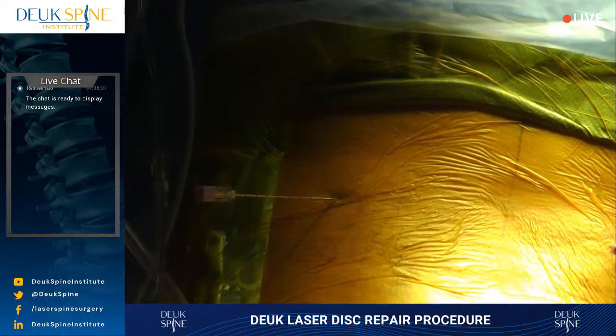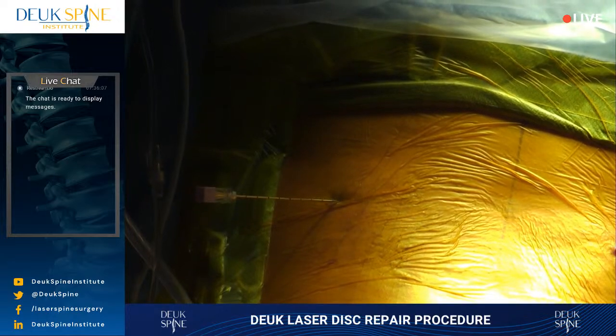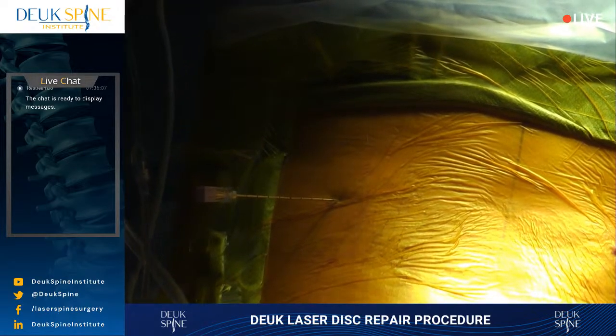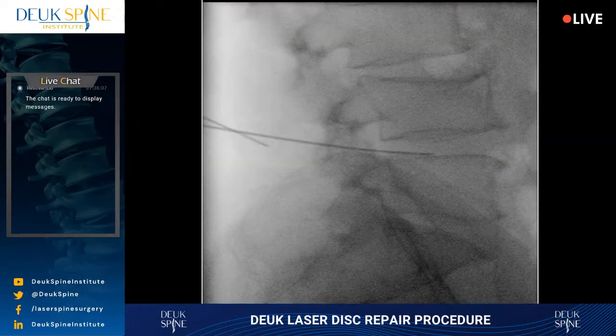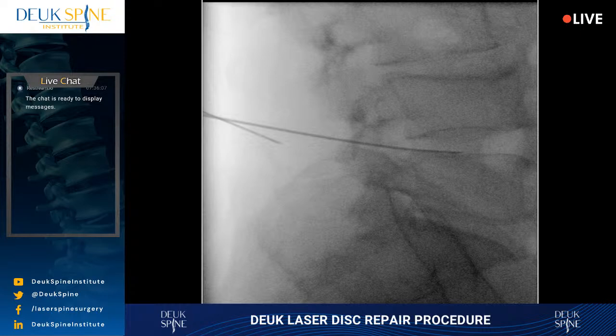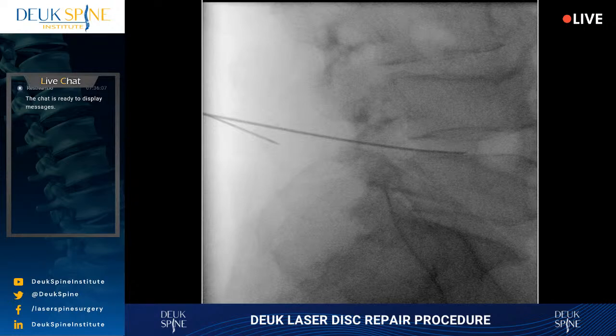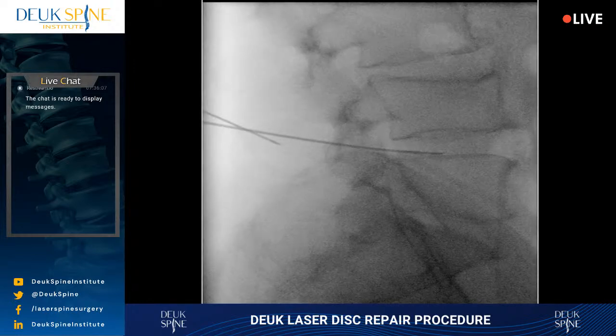So let's just look at the MRI. L5-S1 disc is pretty collapsed, but it should be accessible. You've got to open that foramen up for me, Jordan. You're not horribly off, but maybe it's an orbital issue. Keep going. So right now we're spending some time. Did we go past it? We want to line up our machine so that the pictures we're getting are accurate representations of the anatomy three-dimensionally. I think you're close. That's worse.